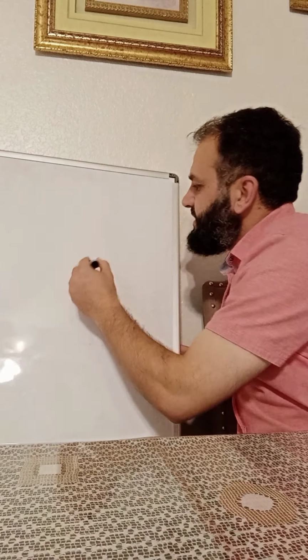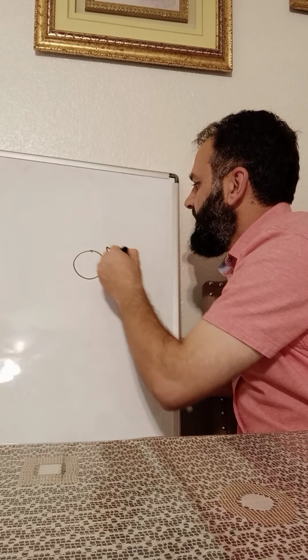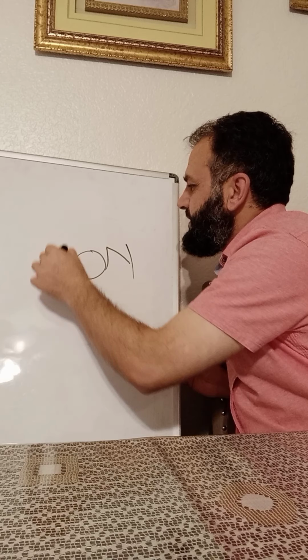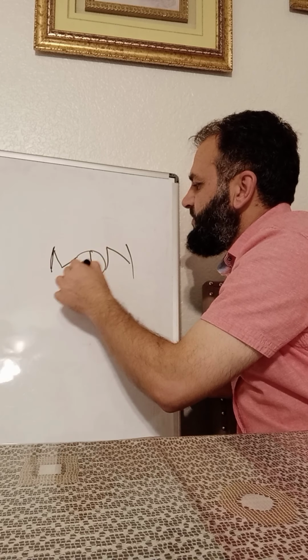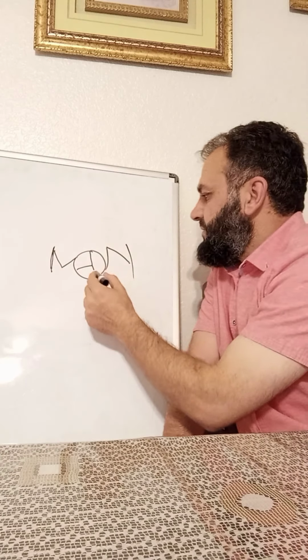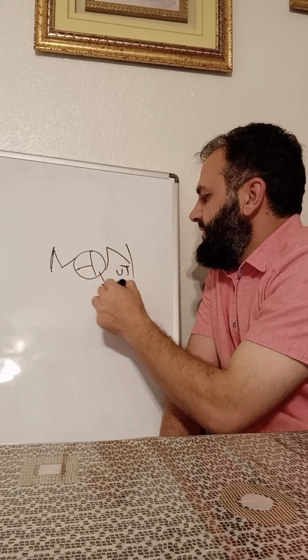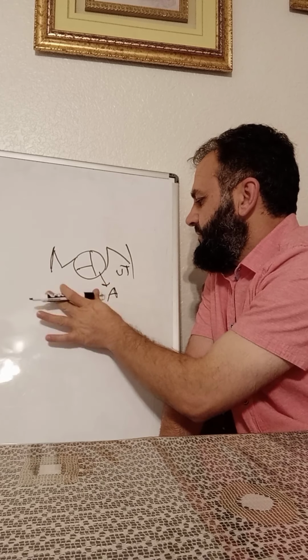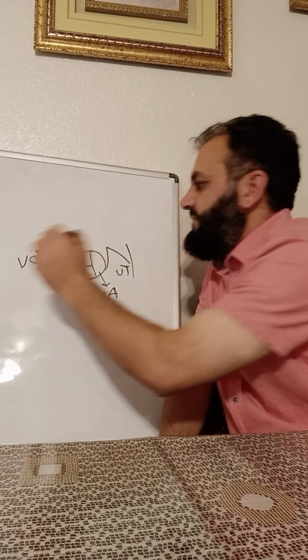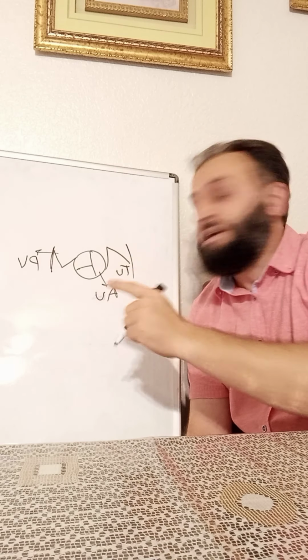If we look on the short axis, mostly we see three valves in this area. One of them is our aortic valve, AV. This is our tricuspid valve, TV. And this one is our pulmonary valve, or PV. Now, our target, our area of interest, is the pulmonary valve.